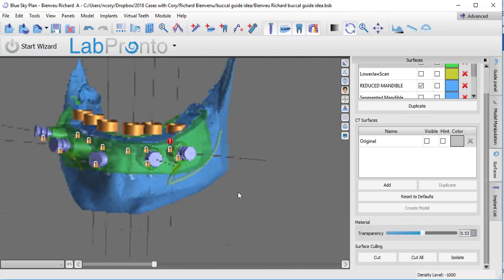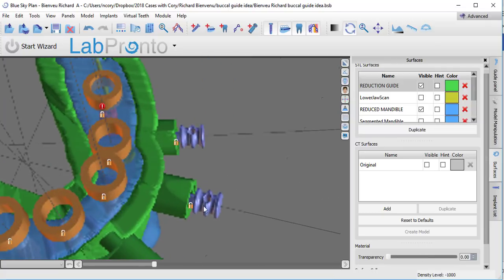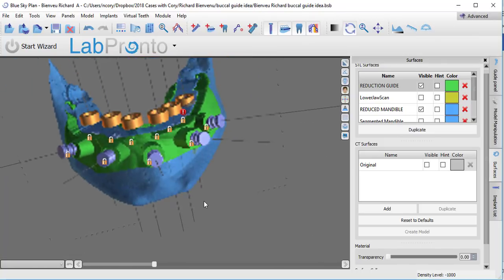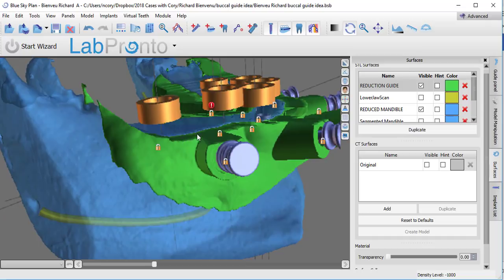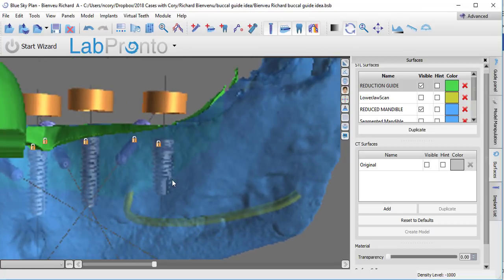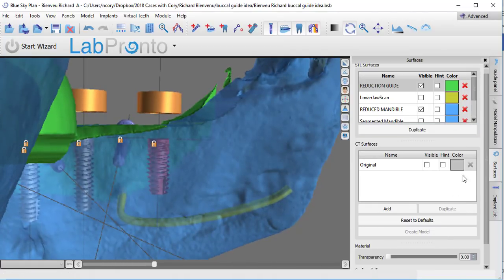All right. Now, to get rid of the little piece that we've got floating back there, I'm going to turn up the transparency so that you can see this better. Here, you see that mesh cut failure. That's the thing it was highlighting for us. We'll fix that at a later time. What I want to do is now go about fixing any little sharp areas. This gives us the plane from which we're going to need to do the reduction. And I'm actually looking at this, and I think I probably need to go just a bit more right here. And so one more cut at this.